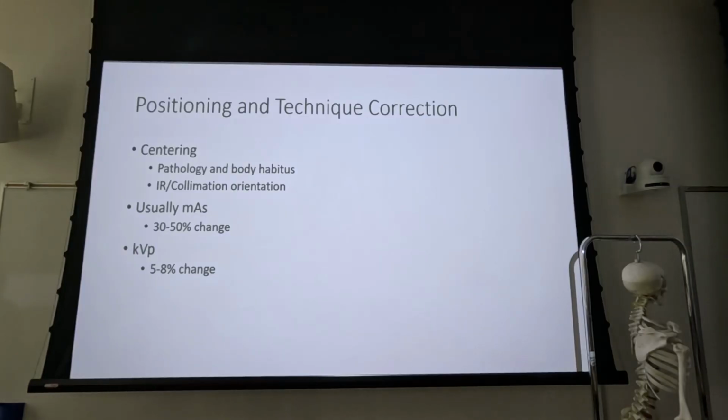All right. So for pathology, you got to know what pathology you're looking at. Right, so is it air? Is it ascites? Does the patient maybe have liver damage? They've got this big distended abdomen. What's causing that? Again, if you have a patient who's got liver damage, they may have a distended abdomen, and you can't tell whether that's because of liver damage, I got a beer belly, or do they have a bowel obstruction? Right, so telltale signs of bowel obstruction before you take the x-ray. Very, very hard as it is. Okay, it's going to be pretty hard.